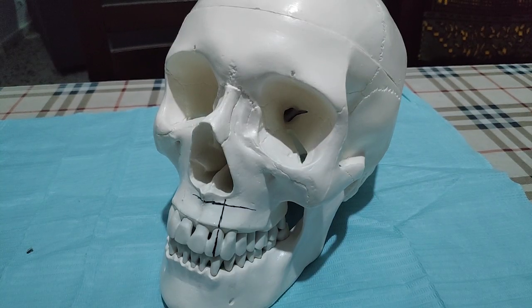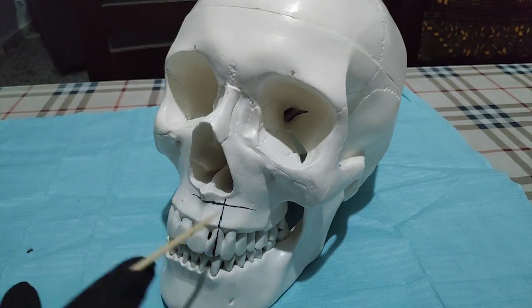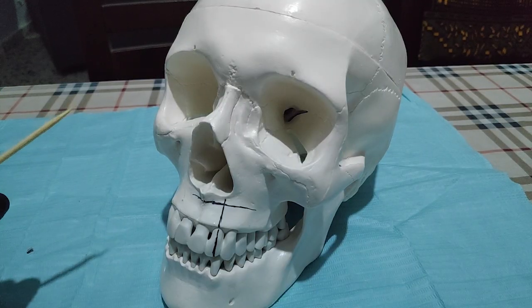Infiltration for upper anterior teeth. The demo will be on the upper lateral. We have two lines: the long axis of the tooth and the mucogingival fold level. The cross between these two lines is the point of insertion.